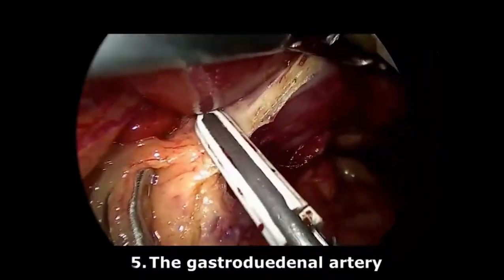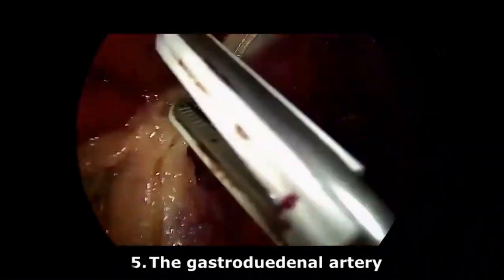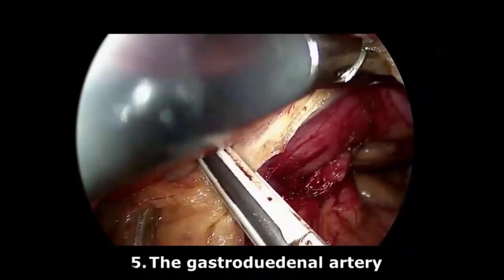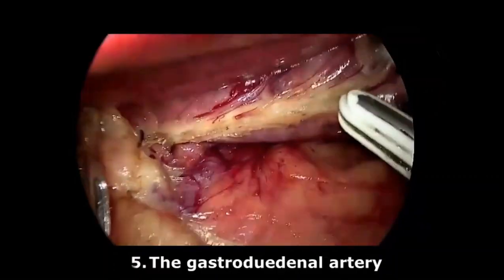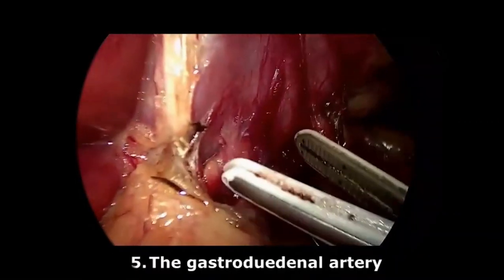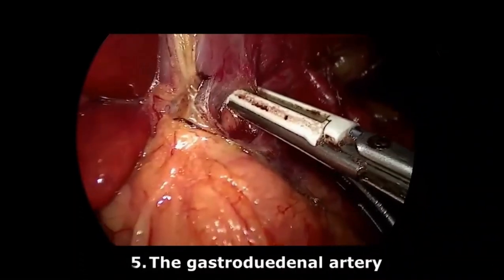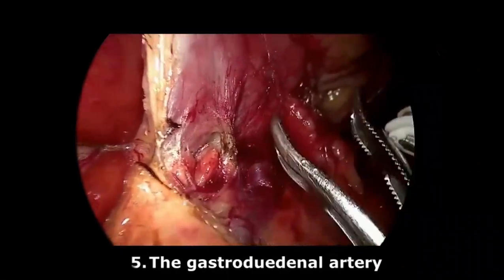Lateral dissection, going close to the duodenum, hugging the duodenum. Now, this is hugging the duodenum, going close to the duodenal serosa. Coagulate some small branches coming from the gastroduodenal artery. All these steps aim to get more length of the duodenal stump.